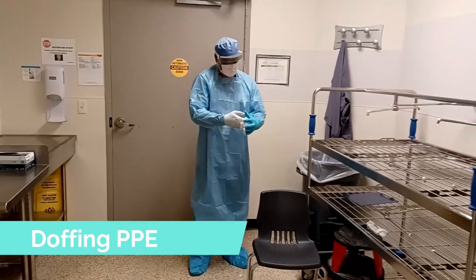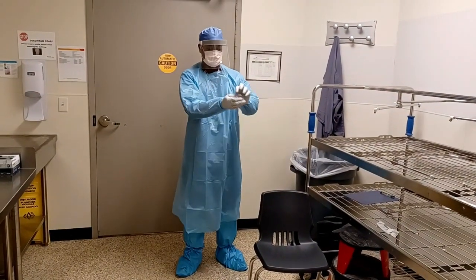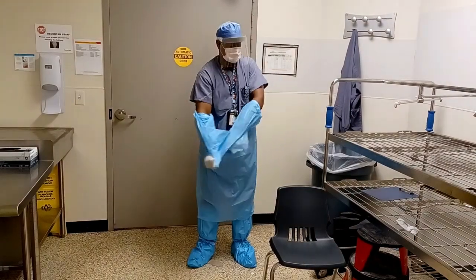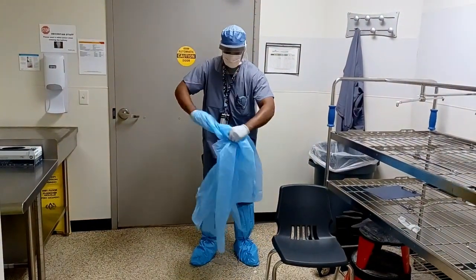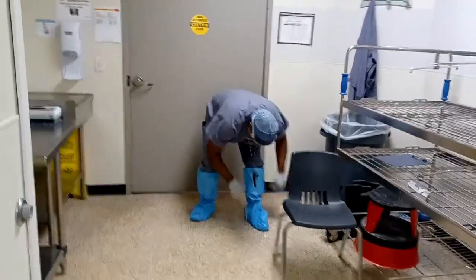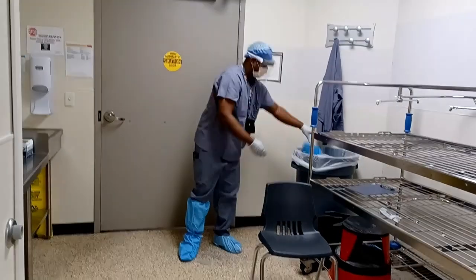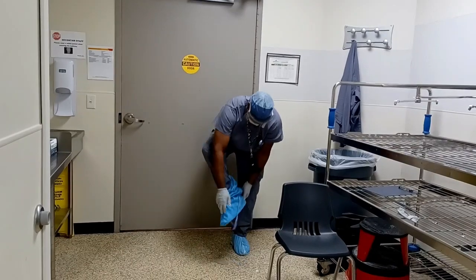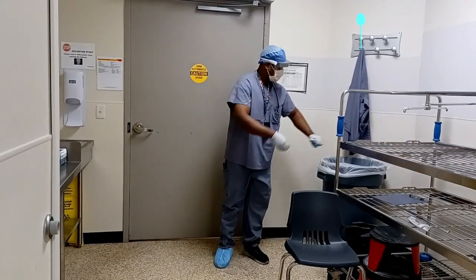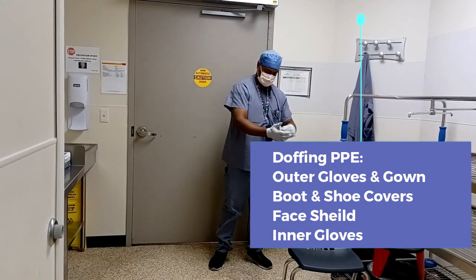Removing PPE — doffing PPE. You remove first your outer gloves. If you have on a second layer, you remove those next, making sure you always pull from the wrist towards the fingertips to contain any contamination. As you remove your gown, you want to make sure you roll it towards the inside so you're containing any and all contamination inside the gown. Next, remove your shoe covers and your boot covers — use a chair if needed to hold your balance. Finally, remove your face shield and then your final pair of internal gloves.